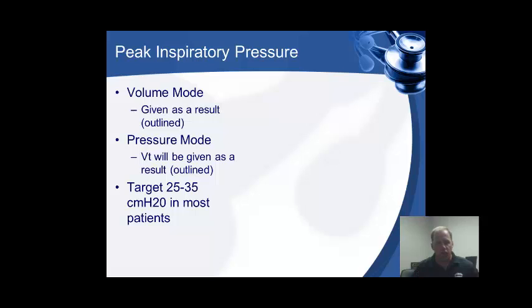If they're 5'2" and they weigh 250 pounds, we know that we're not going to ventilate that person at 600 or 800 mils, because they don't have those size lungs just because they're overweight. Use ideal body weight based off of height, use a chart or whatever to calculate that, and we're going to do some calculations to get some tidal volumes to give us a good start.